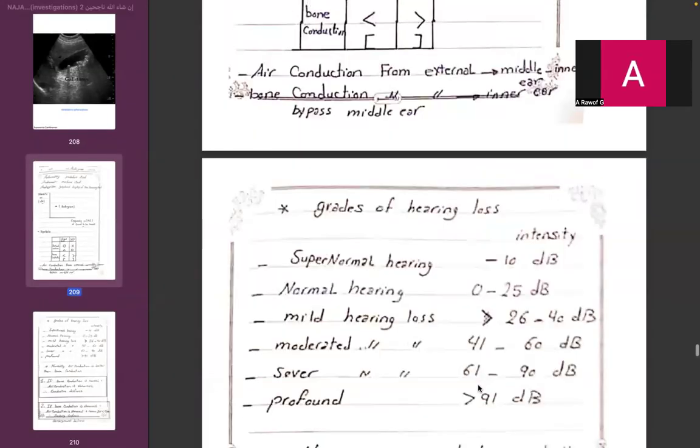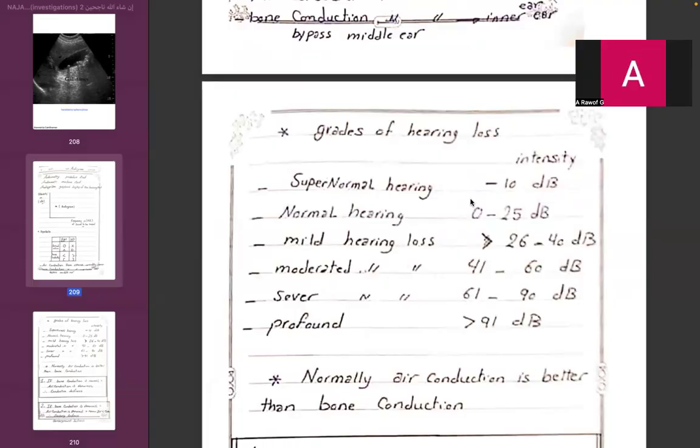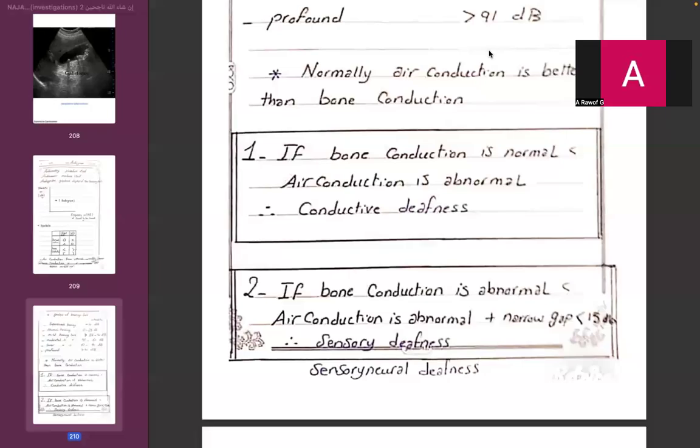Okay, grades of hearing loss. Normally, air conduction is better than bone conduction. We all know that normally air conduction is better than bone conduction.